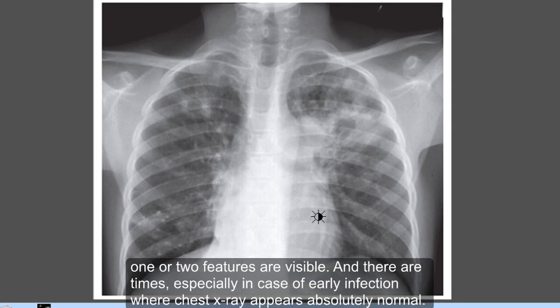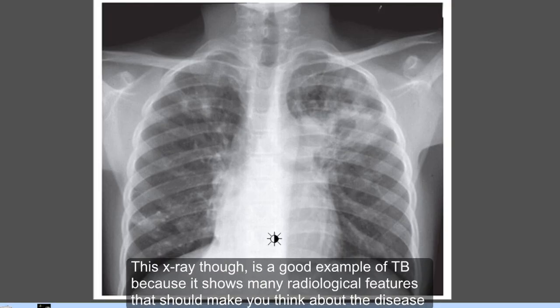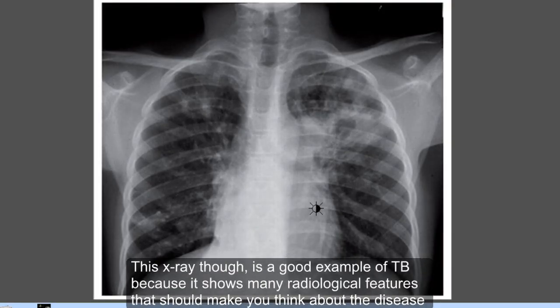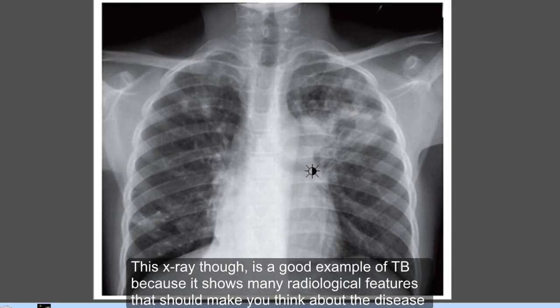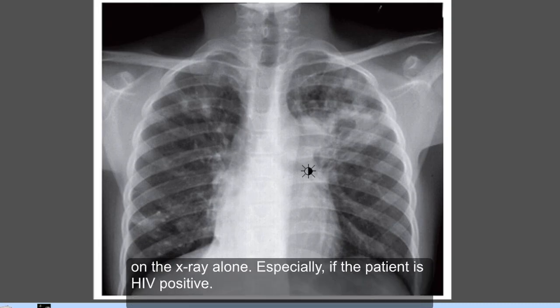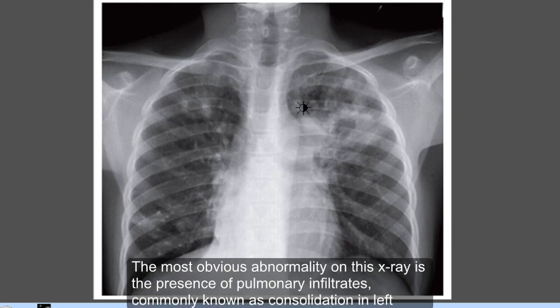Displacement of the hila and fissures is also common. Many times only one or two features are visible, and there are times, especially in early infection, where the chest X-ray appears absolutely normal. This X-ray is a good example of TB because it shows many radiological features that should make you think about the disease on X-ray alone, especially if the patient is HIV positive.